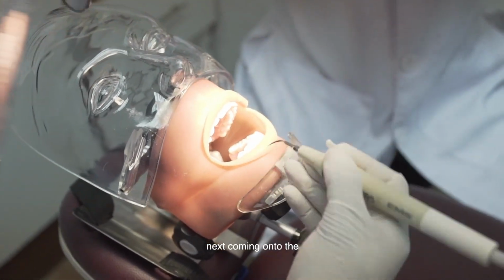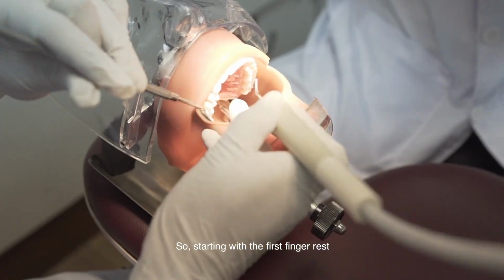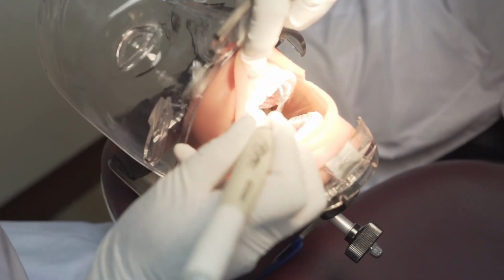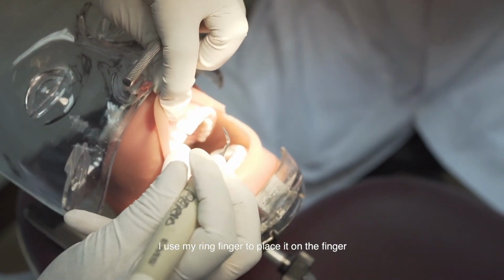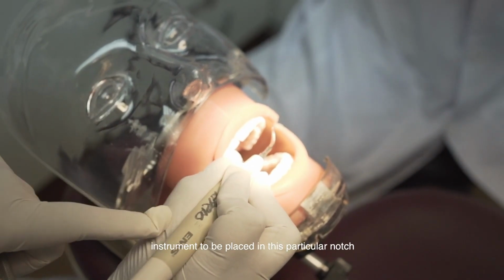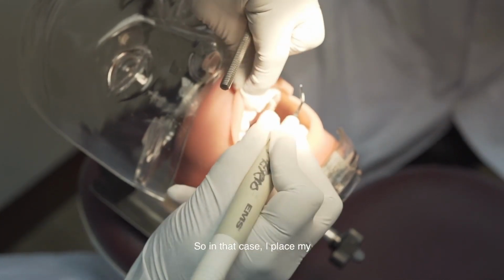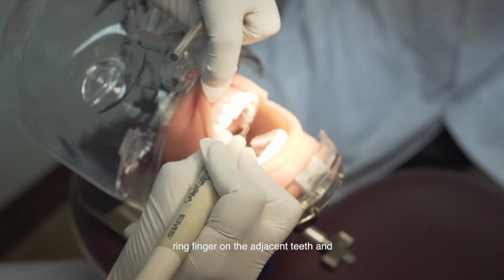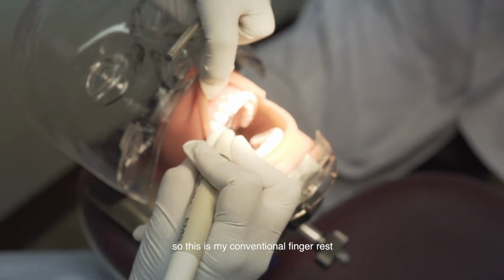Next, coming on to the intraoral finger rest. There are 4 types of finger rest. Starting with the first, my conventional finger rest, where I take support from the adjacent teeth. I use my ring finger to place it on the tooth, I place my instrument in this particular notch, and my little finger is closed like this. I place my ring finger on the adjacent teeth, and when activating my instrument, I activate in this way. So this is my conventional finger rest.